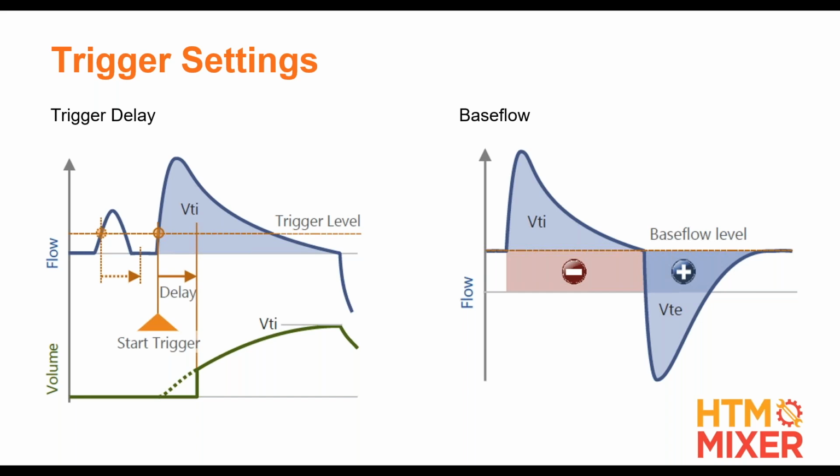Work great. But I started down that rabbit hole before I got to that point, going, what's going on here? Grab another analyzer and put it in place. And that analyzer said, oh, it works fine. These are perfect. And there must be something wrong with this analyzer. It's out of calibration or something like that, you know. No, it's a simple setting. So, and I thought I knew everything about that analyzer. And I thought I'd checked it. So, you know your analyzer and check your settings twice, because it happens to everyone.